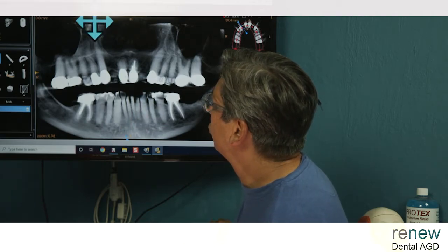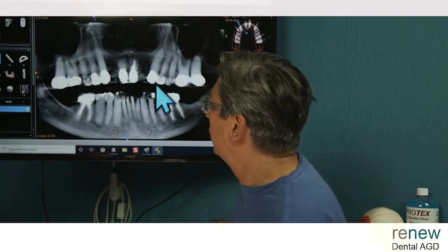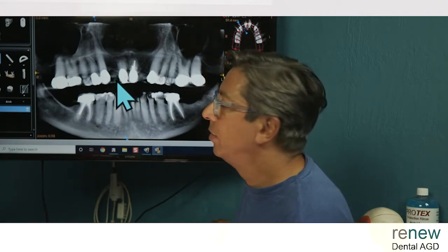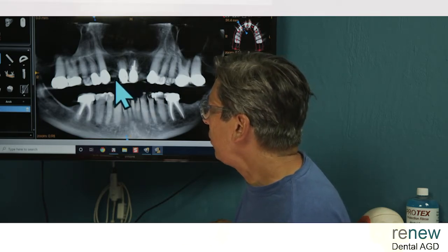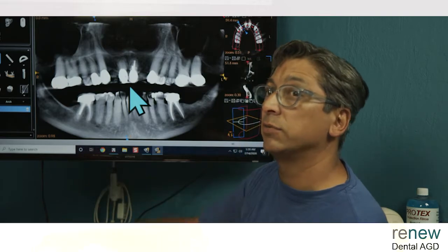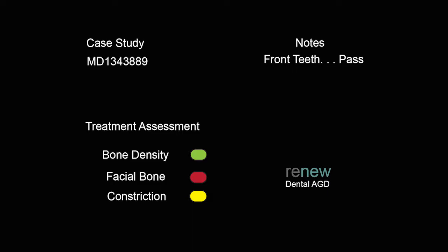But let's look closer at why I'm saying let's take a pass on this case unless he wants to do something else. Right now he just has a stay plate that he has for the laterals, and he's had that for a while. But when you look in our three-dimensional viewpoint on the CT, you'll really realize what the problem is. First, let's look at our treatment assessment. That is going to be pretty good on the bone density. That's not a problem. That's a light green.